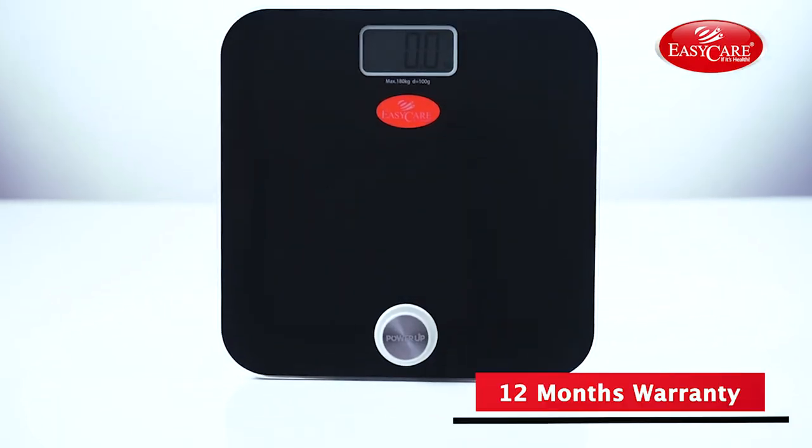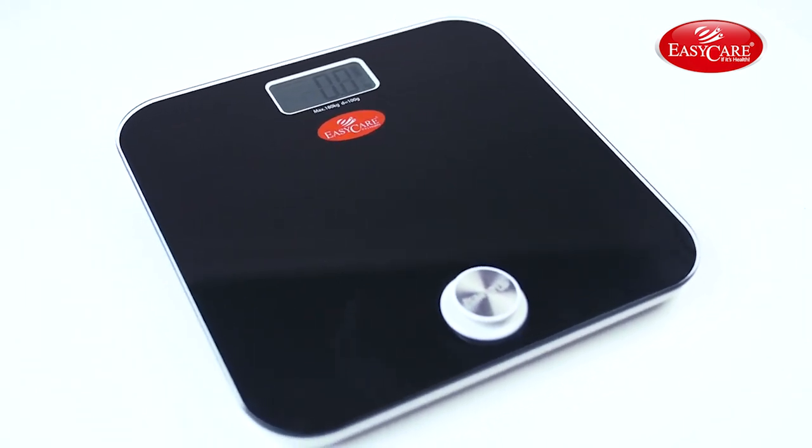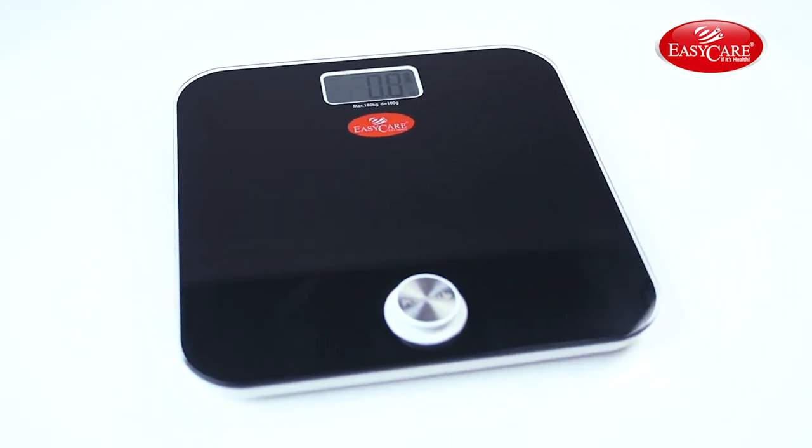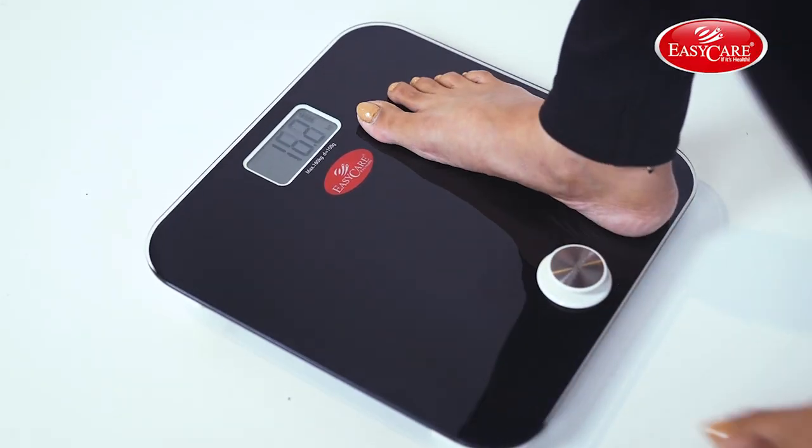It comes with a 12-month warranty. This is an absolutely easy-to-use product that is clinically validated and number one doctor recommended. Just press the power button, step on the scale and it's done!